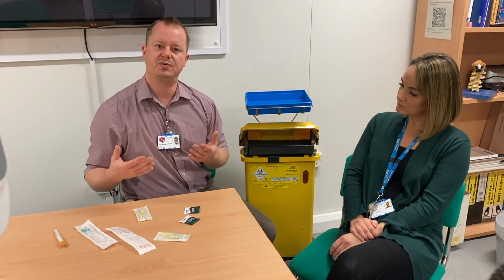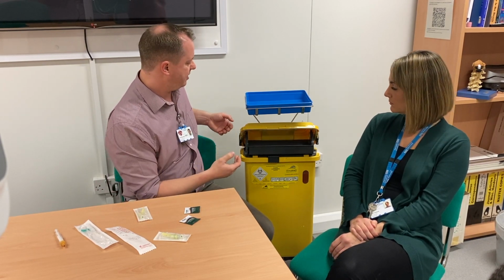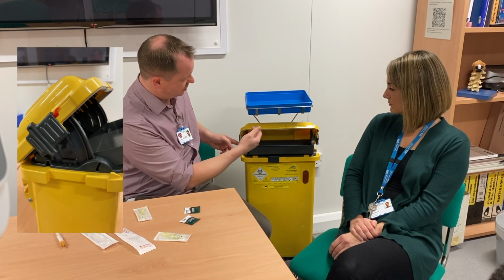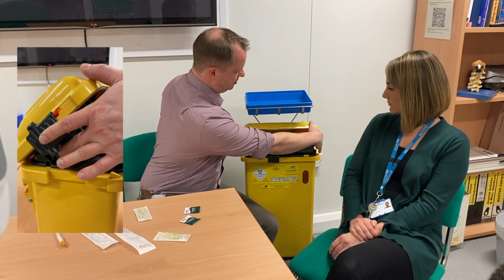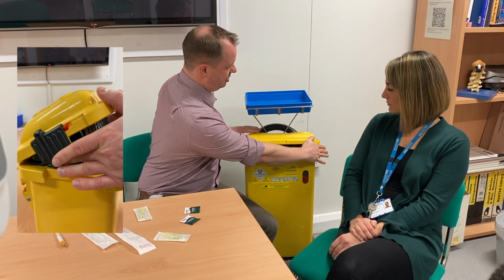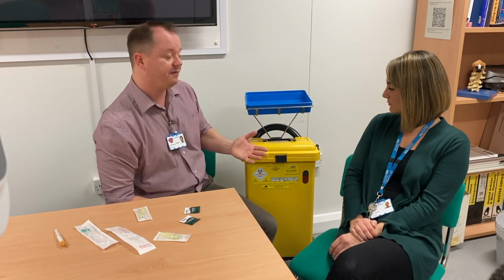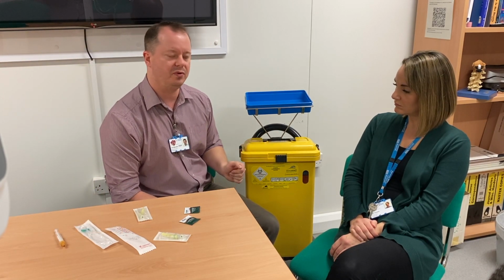When you finish with your Sharp Smart device, it's important to close the lid. On either side of the actual hinge are these little buttons that just pull a catch away, so you can lower the lid down, pull the slider over, and then you're finished. You can place it where you found it on the ward.